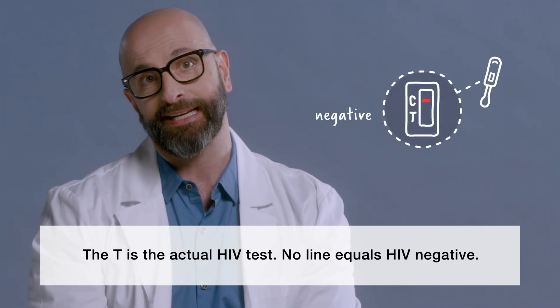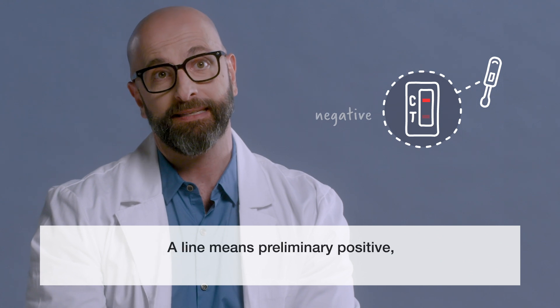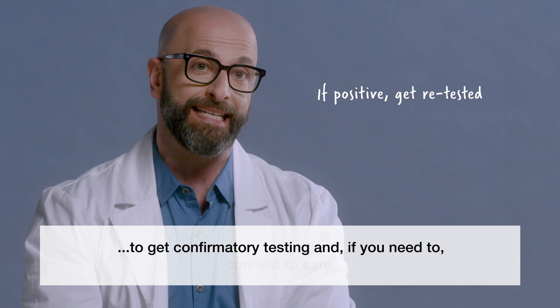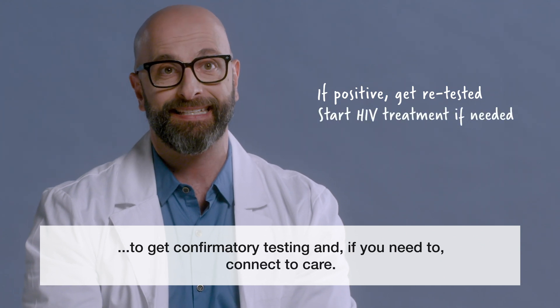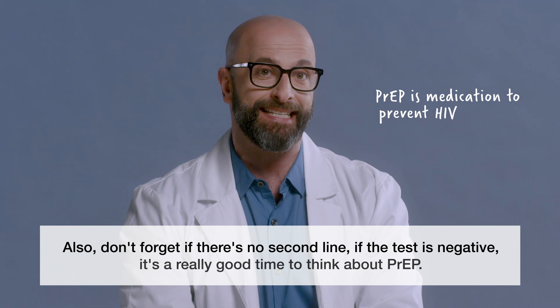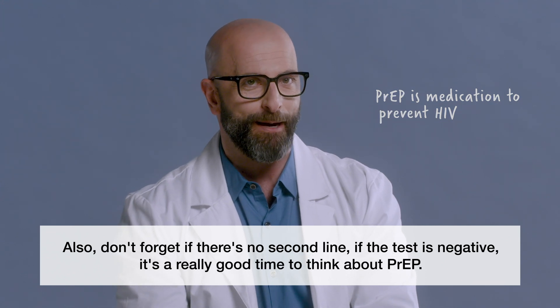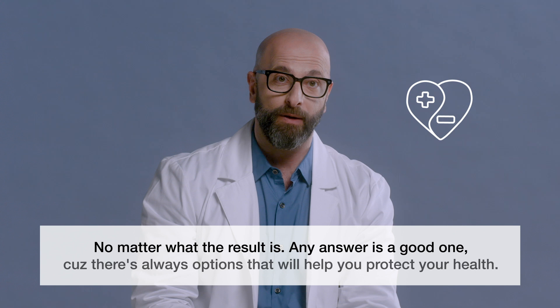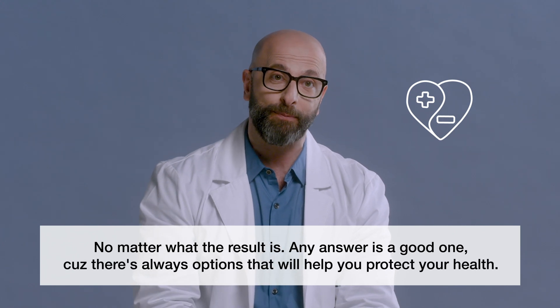No line equals HIV negative. A line means preliminary positive, and it's important to go see a health care provider to get confirmatory testing and, if you need to, to connect to care. Also, if the test is negative, it's a really good time to think about PrEP. No matter what the result is, any answer is a good one, because there's always options that will help you protect your health.